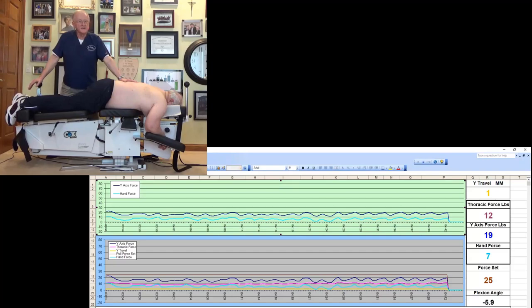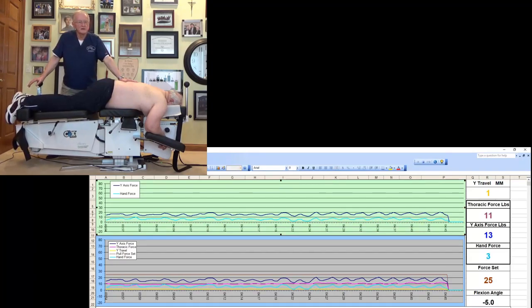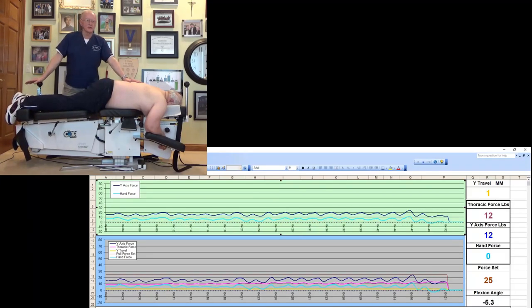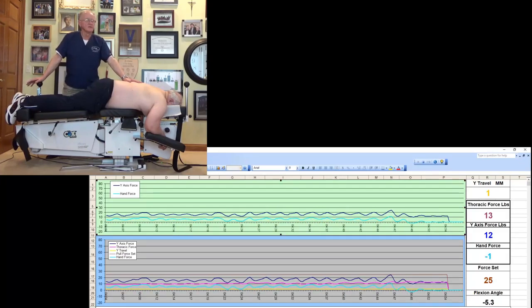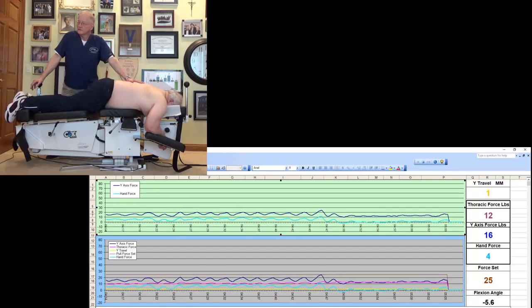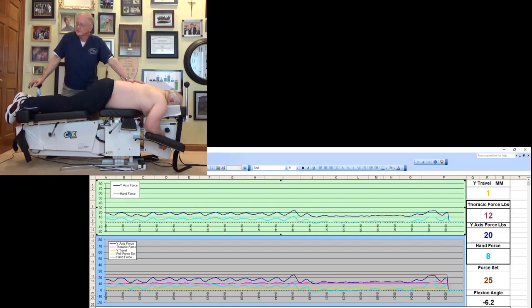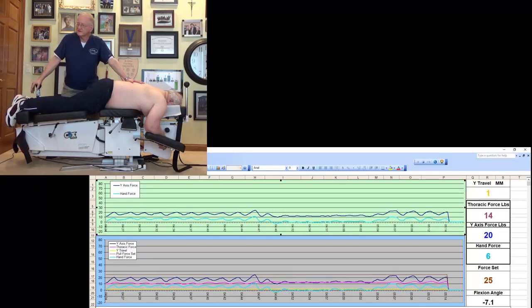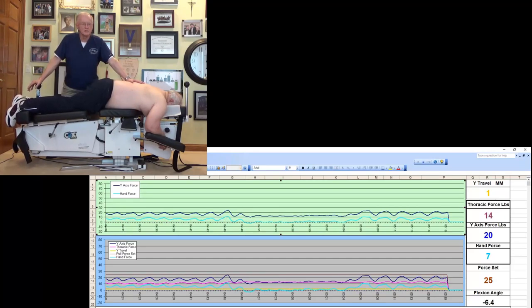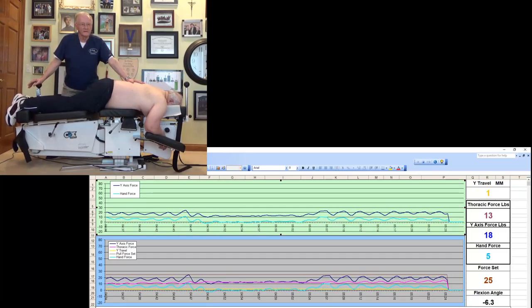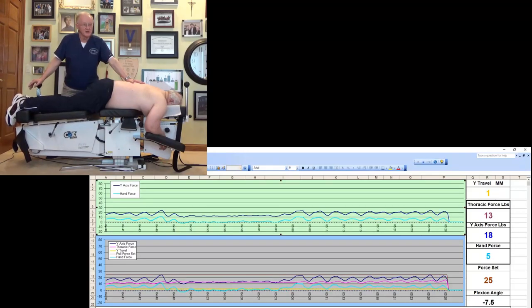Now let's say that I were to move higher to say L1 because I'm, say I hit thoracolumbar degenerative disc disease. Now you'll know that the higher I go, the more force I must use because I'm distracting several motion segments. But I move to the taut point. So if I'm going all the way up to L2, you'll notice that I'm using here, if you read the second from the right, I'm using seven, eight pounds of distraction. And you'll note the smooth rhythmical oscillation of protocol one in the treatment of spinal stenosis. In this case, due to lumbar disc herniation.